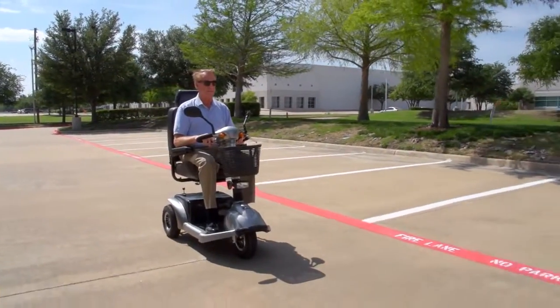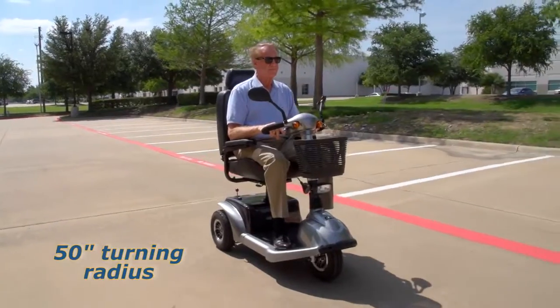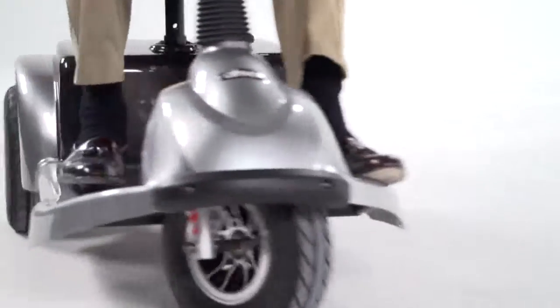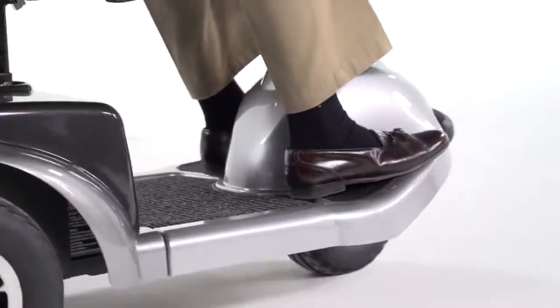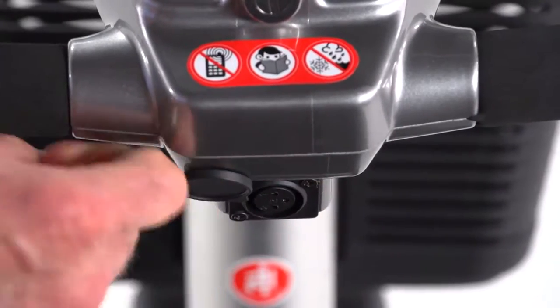With the Prowler 3-wheel version, you get great maneuverability in smaller spaces with a 50-inch turning radius and an extended footboard which benefits taller riders. And when the battery gauge shows the need for recharging, it's simple via the port on the control panel.